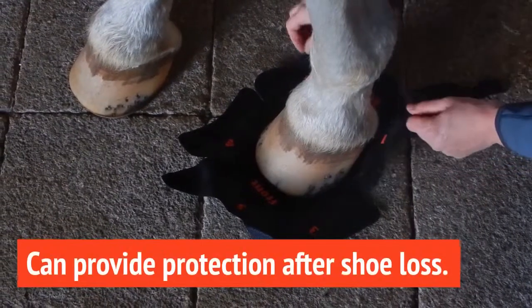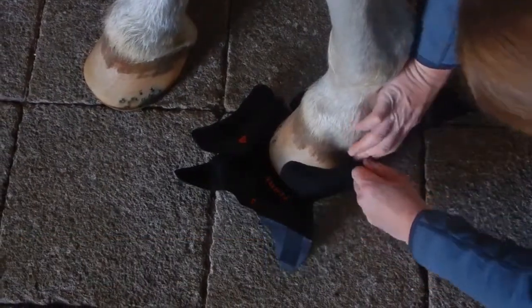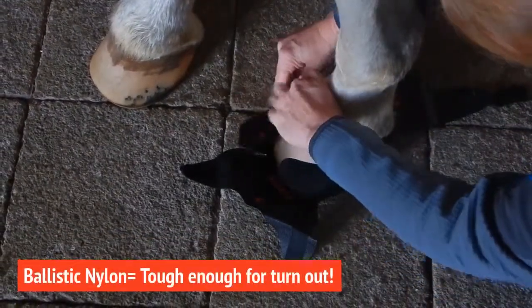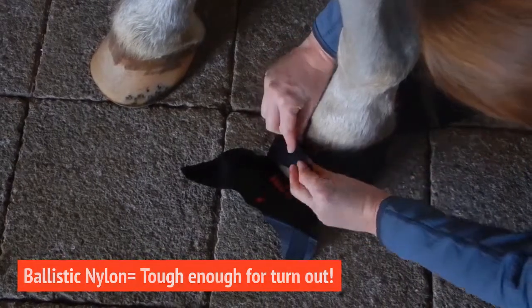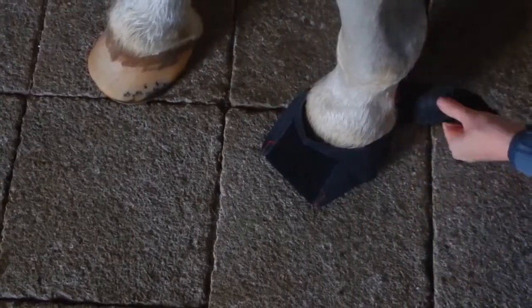Hoof Wraps bandages are made with 1600 denier ballistic nylon and reinforced with industrial stitching, so the bandage is tough and stays on. You can reuse the bandage several times, and sometimes even up to two weeks or longer, depending on the horse and the conditions.